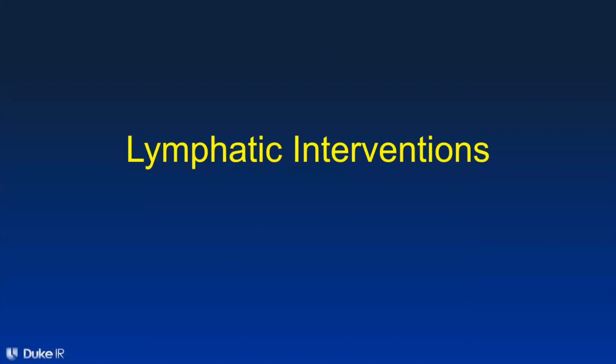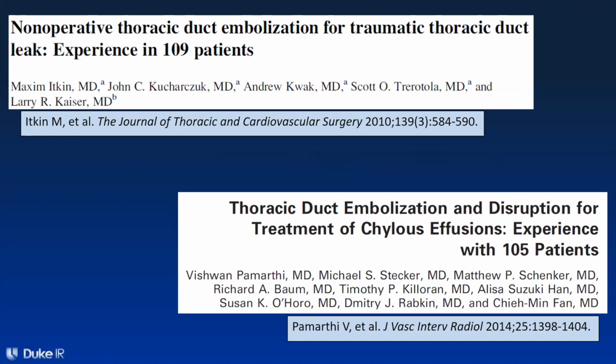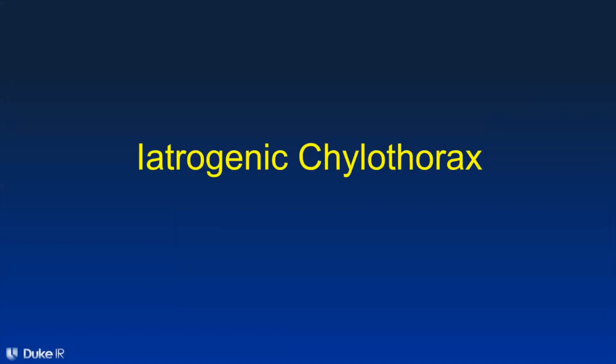So now what? Time for the presentation has now expired. Now I'm going to show 4 very quick cases of lymphatic interventions. Why do we opacify the thoracic system? Basically, in general, most of the time to treat leaks, although there are other causes or reasons to catheterize the thoracic duct.